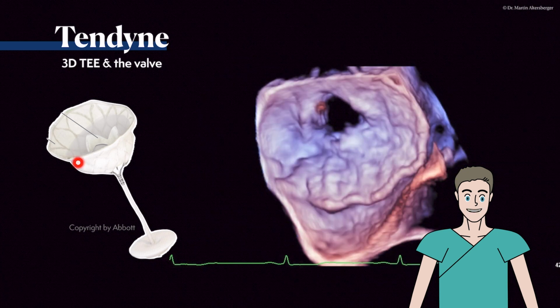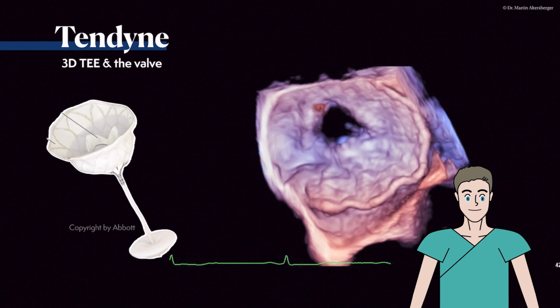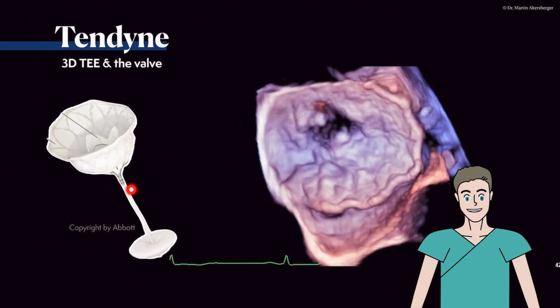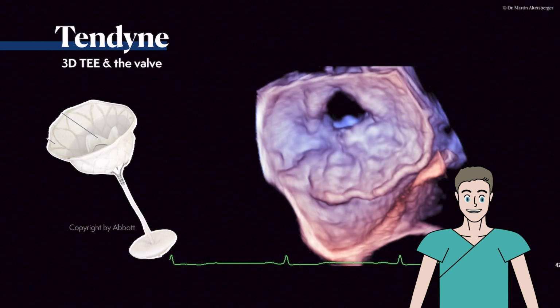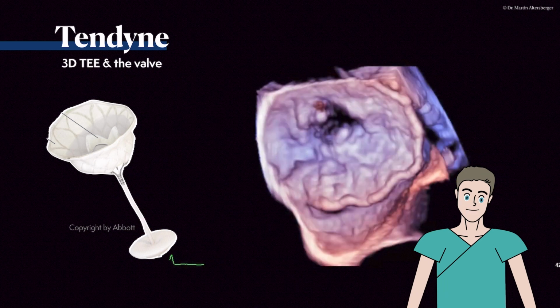So here we have the umbrella-like structure, and this is the structure we will find at the apical region. So this is at the area of the atria, and here it goes to the ventricular side. So, a minimally invasive valvular implanted structure.